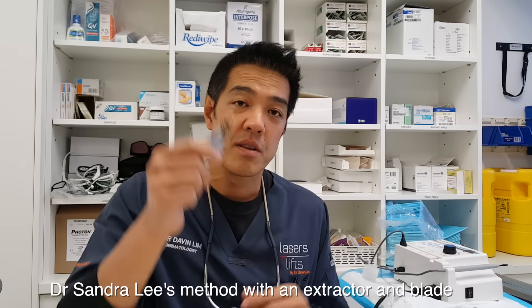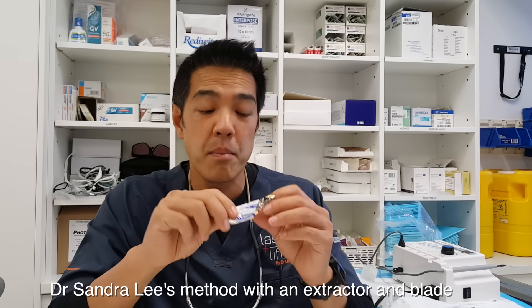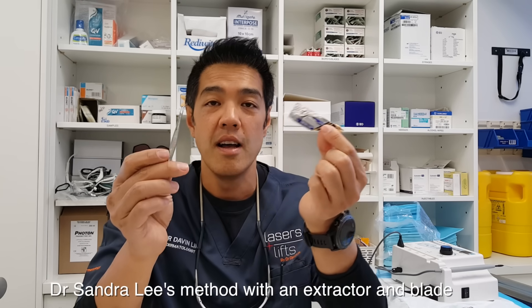Another instrument I use, and this is one of Sandra Lee's favorites, is basically a bladed instrument. A bladed instrument combined with a comedone extractor can give fantastic results for dilated pore Winers.